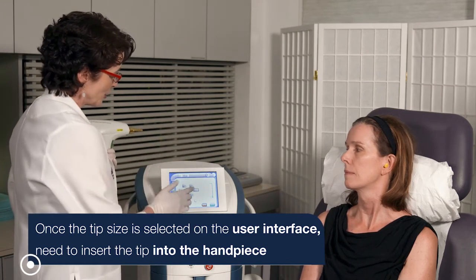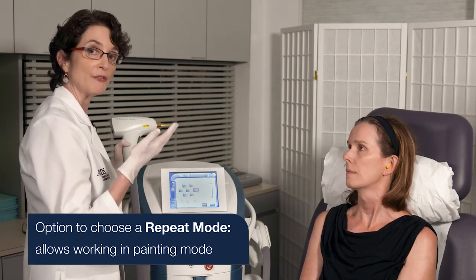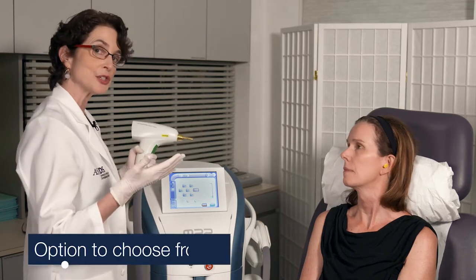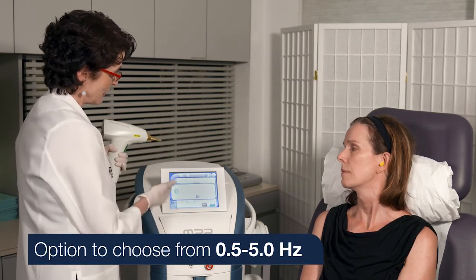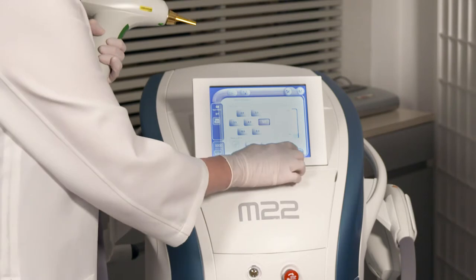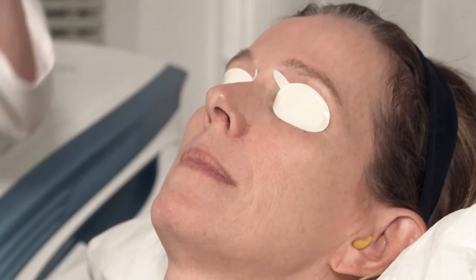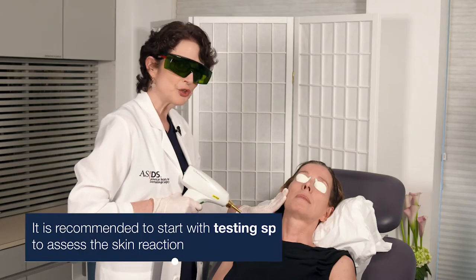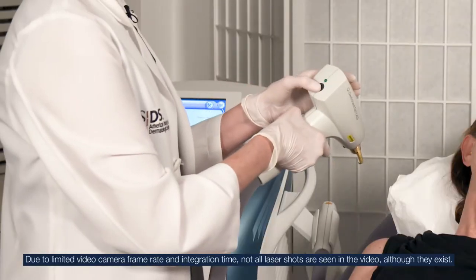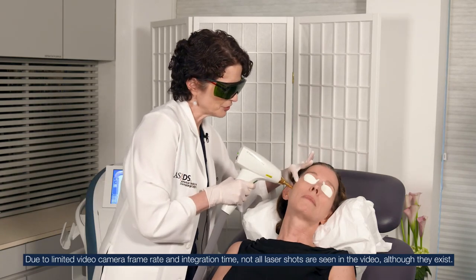Now I'm going to look at repeat mode. Because I'm doing paint mode, I'm going to set higher hertz — we'll go at 5Hz, up to a maximum of five. If I wanted to go slower I could set it down. I'll press ready — it asks me to verify my selected tip. Yes, I have 5mm. I'm going to tell Mimi we're going to do a little test first to get her used to the sound. I press ready and the light goes on.